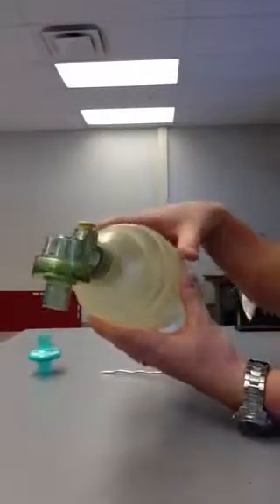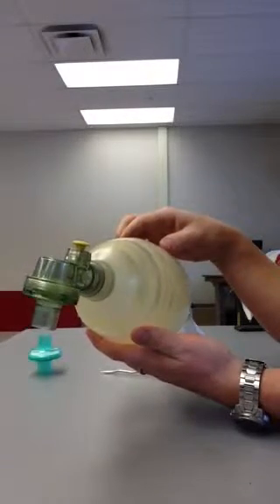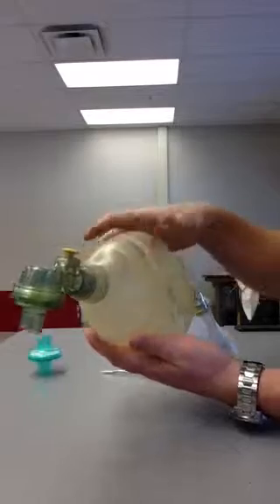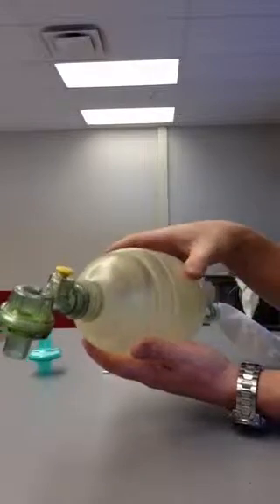A couple different checks for the BVM here. First, simple check: squeeze it and see if it self-inflates. The self-inflation will tell you that those valves are properly working. When you squeeze it, that compressible body should self-inflate, regardless if there's an oxygen source or not. That's one of the features of a self-inflating bag.